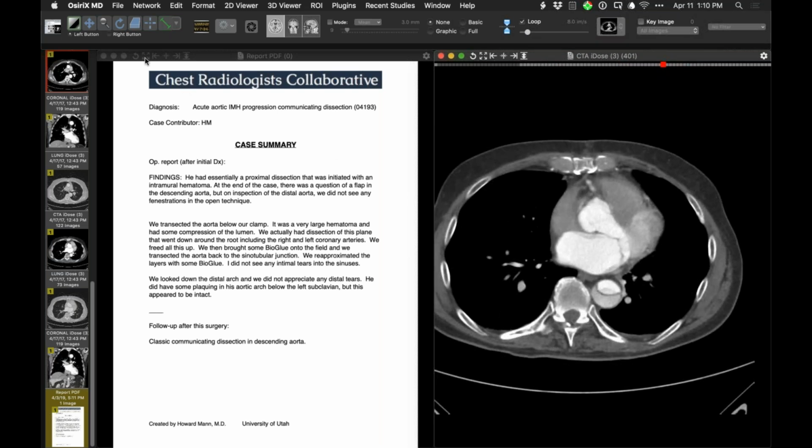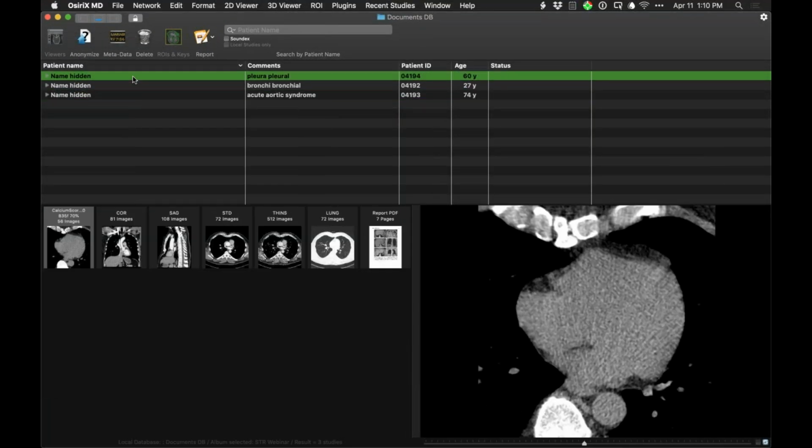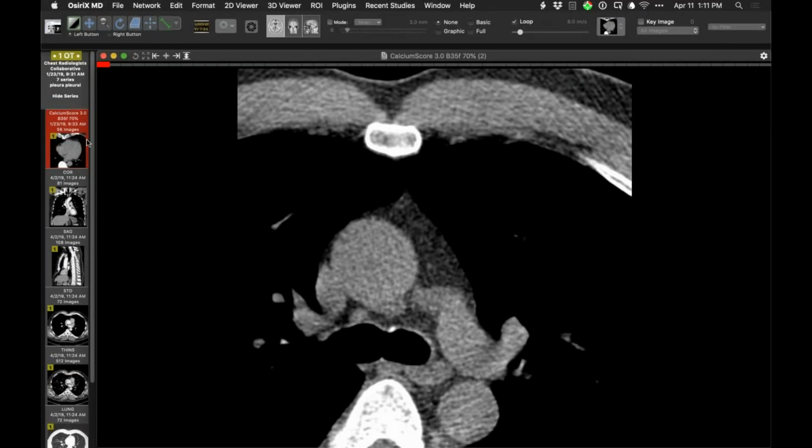So interesting. Is David on? Let's see if I can see. Yes. Okay. This is going to be for David a contralateral deja vu. So you showed a case 2 weeks ago exactly. And then as things happen, I came across this the other day.